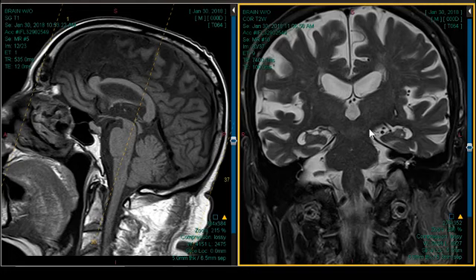One thing I try and do with these dementias, besides the approach that I've given you, is I kind of break them down in my head. When I'm going through the search process and trying to decide posterior fossa, supratentorial, frontal predominant, parietal predominant, how it's affecting the temporal lobe, what's the status of the entorhinal cortex, is the subfrontal region involved, what's the distribution and makeup of the brain iron. Then I start looking back at the history, I start digging a little bit. If I have to pick up the phone, I will. And then I go by organelle. Could it be mitochondrial, could it be lysosomal, could it be a peroxisomal disorder? Because there's just so many of them.